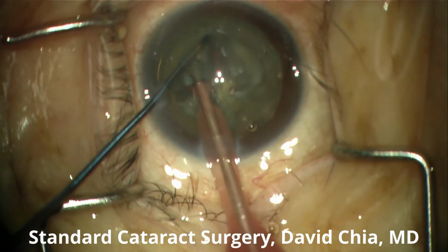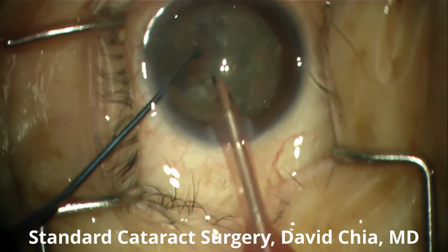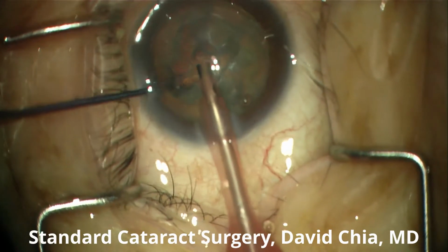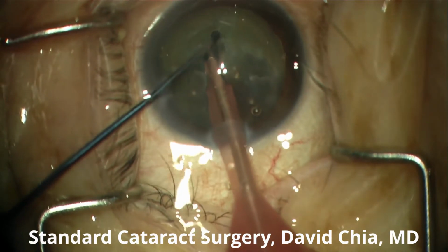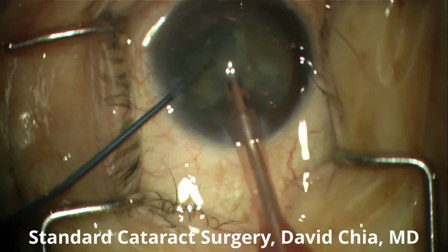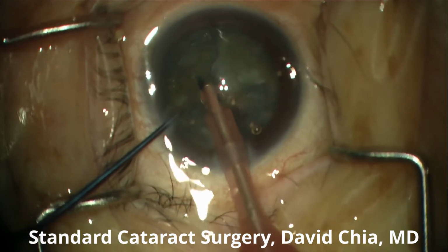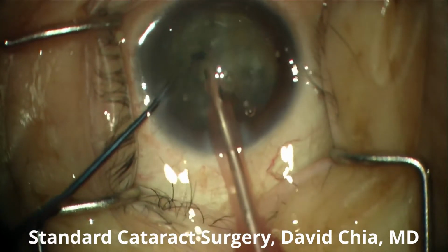So this is during the quadrant removal step, and you can see that the material is actually falling very well into the tip of that phacoemulsification handpiece, and so it's removing some of that material. Our goal is to try to remove the material using as little machine energy as possible, because this can create a lot of energy with the needle moving, as we said, 40,000 times a second.